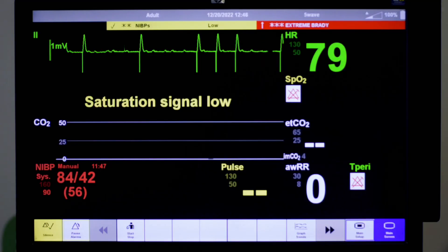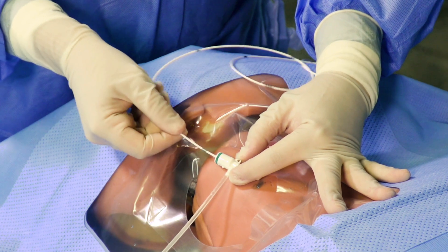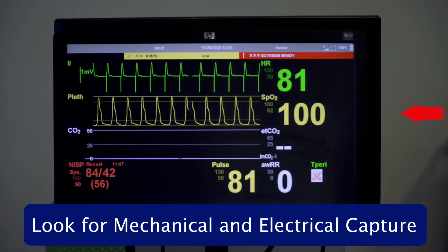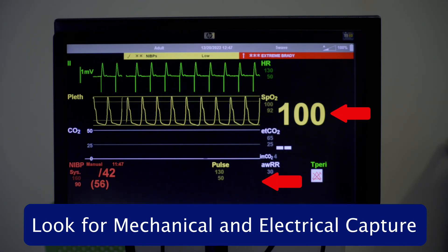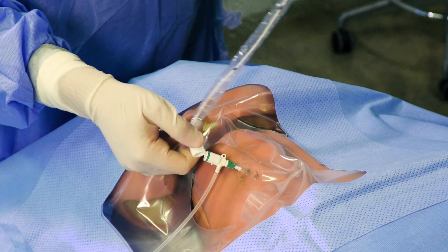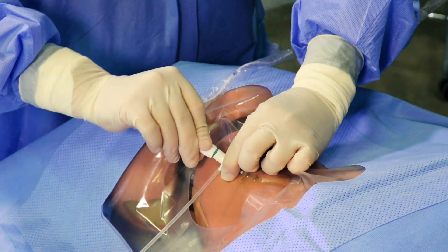Turn the monitor's heart rate source to either the SpO2 or arterial line if available. Advance the wire to 20 cm, at the two black lines, and inflate the balloon. Advance the pacer wire and watch the monitor for capture. Ensure there is mechanical capture after achieving electrical capture. Once capture has been achieved, deflate the balloon, secure the sheath with sutures, and obtain a 12-lead ECG and chest x-ray for confirmation.